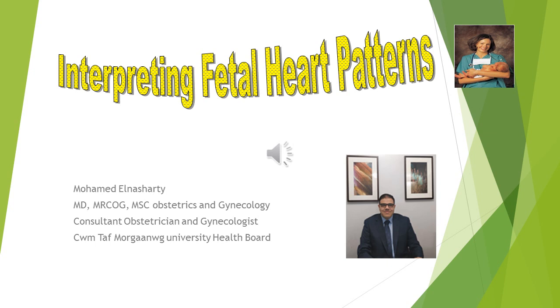We will speak about interpreting fetal heart rate patterns. This presentation is based on the NICE guidelines, which were published in February 2017, discussing fetal heart rate interpretation.